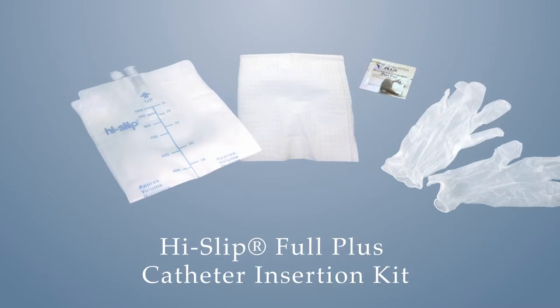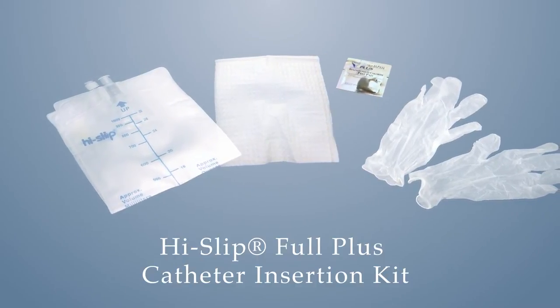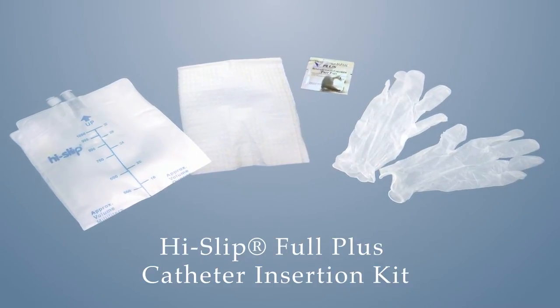The insertion kit contains everything you need to maintain a sterile cathing process. Its contents include a prep wipe, an optional urine collection bag, a sterile drape, and latex-free gloves.